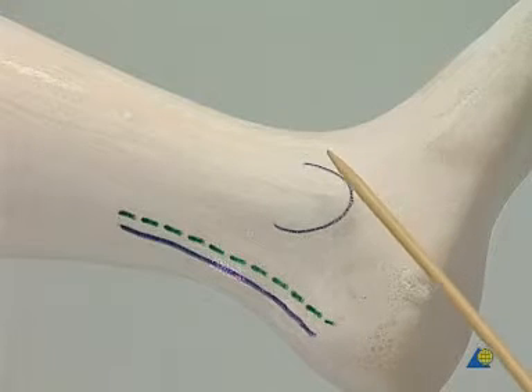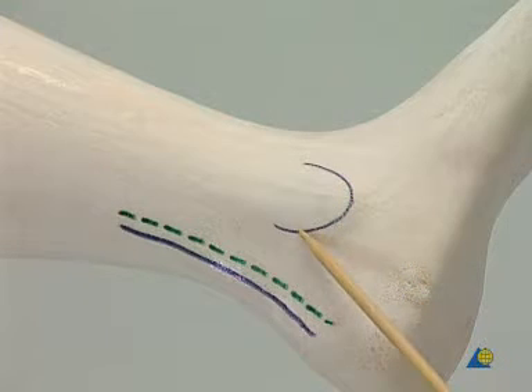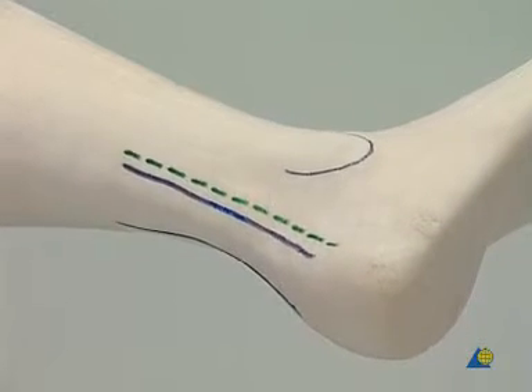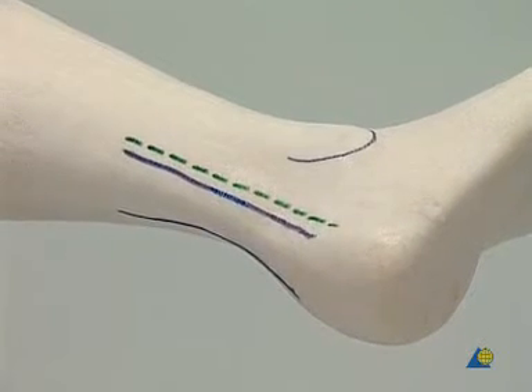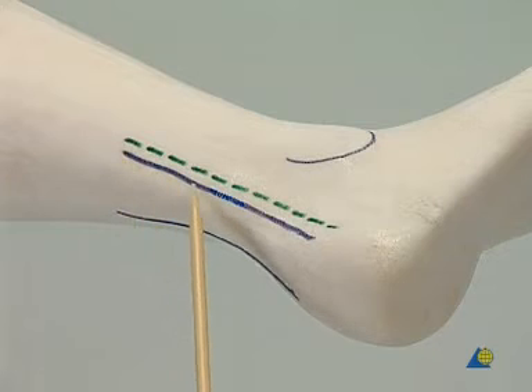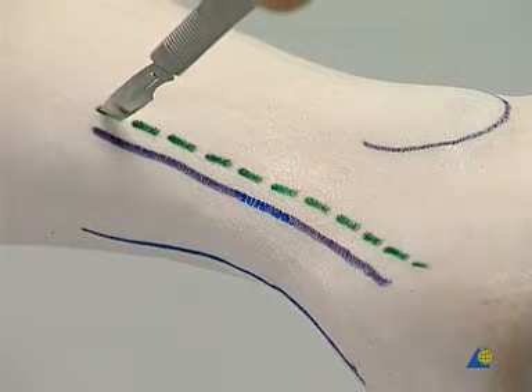This is the lateral malleolus. By rotating the model internally, the heel cord becomes visible. The skin incision is made.